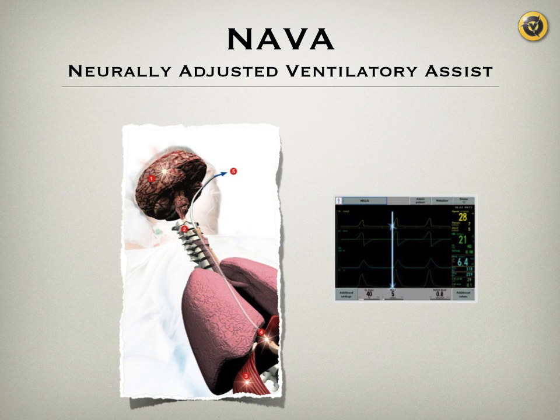I'm not sure if this form of ventilation is advantageous in adults. I don't think there are any studies to prove that. It's definitely advantageous in pediatrics, and this is where most of its use is happening.